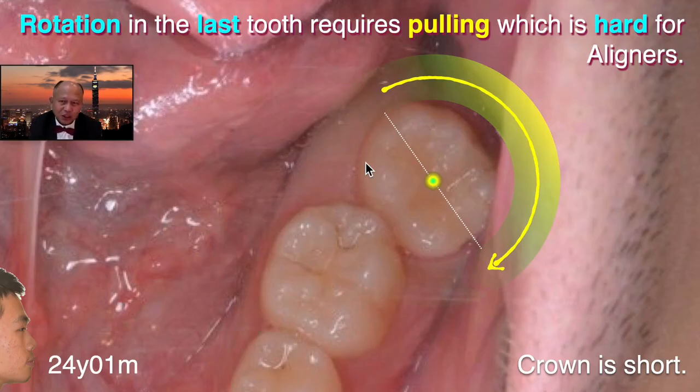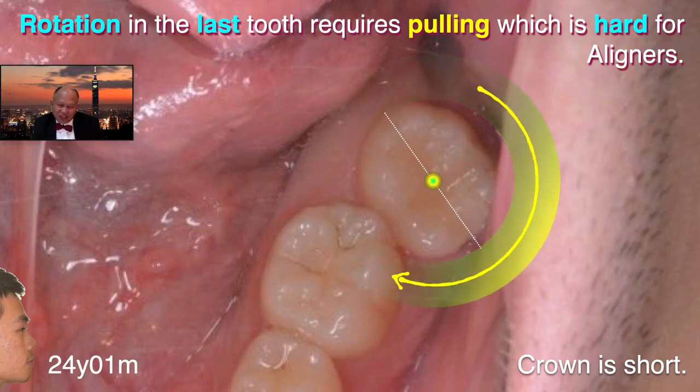And the last tooth in the aligner makes the situation even worse. That's why this situation will be very difficult for aligner only. You have to come up with something different. Otherwise, it will take you forever to solve this one, unless you just pretend you didn't see it. But unfortunately, the patient recognized the problem because this is a referred case. The dentist already said, you have a rotation, you better rotate this one, otherwise there's no occlusion right there.